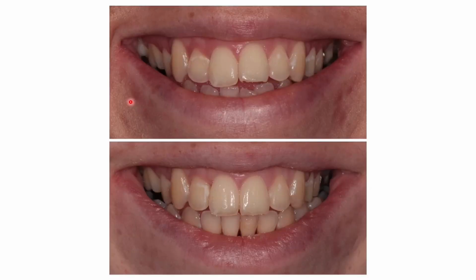That's us at the end of alignment, and actually we achieved a bit more than we thought we were going to get here. We got class 1 on our incisor relations, and we did actually get an overlap there, so it was a positive overbite in the end, which we were pleasantly surprised by. I'm just going to make an observation about it. We've improved the alignment, but the smile itself is still probably just not quite, it's not singing at us. So it's okay, but it's not brilliant.